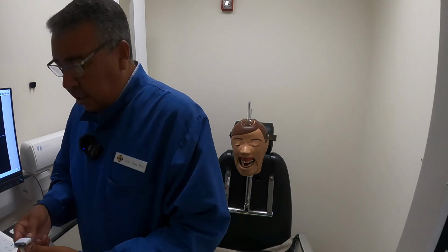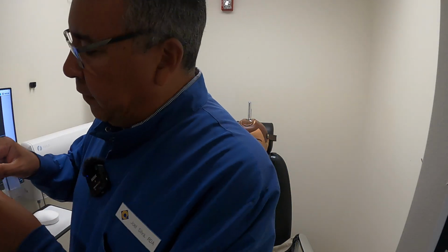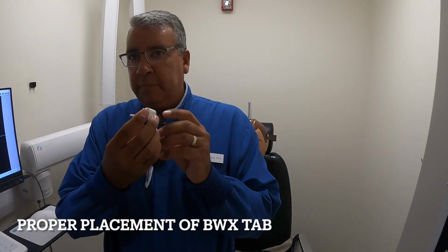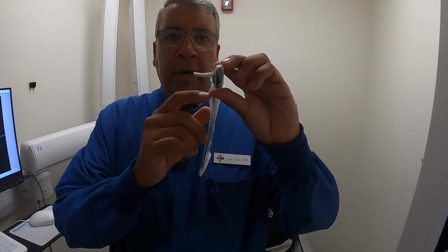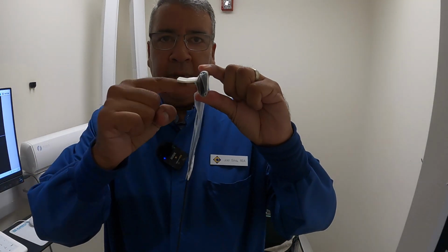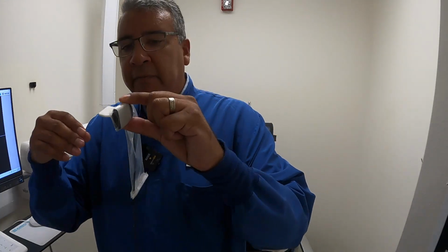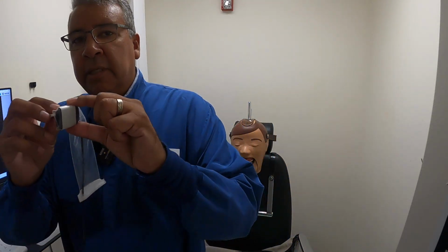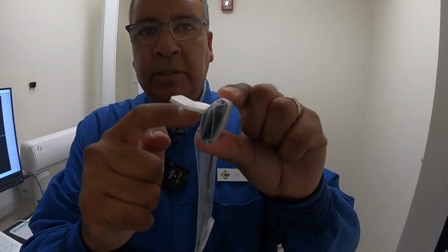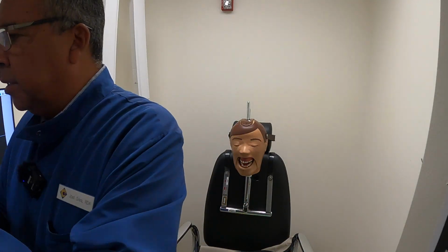So I'm going to take this off and I want you guys to see it. So we have the tab currently. If I go to the side, I'll show it to you. On this one, the tab is set higher, so you have a little piece on top and more on the bottom, so your bite will not be even. You'll get more of one arch and not enough of the other one. The other thing is the tab is not on the plain side, it is on the side that has the cord. And it's okay, this is how we learn.